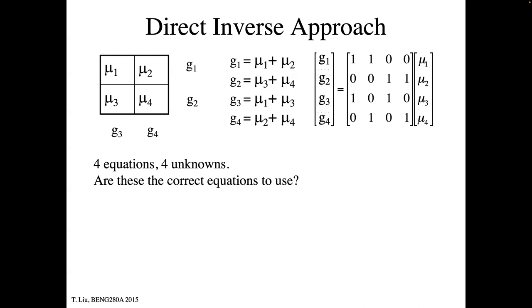Okay, so getting back to your question: if we have just these projections, the sum of all this attenuation, how do we invert our data such that we get an estimate of mu at a specific location? So we're going to start out, and this is just how this works in principle. You do it for this trivial problem, and the principle is the same for a really big problem. Let's suppose we have an object and we're going to break it into four pixels. So we'll get four unique estimates of mu values.